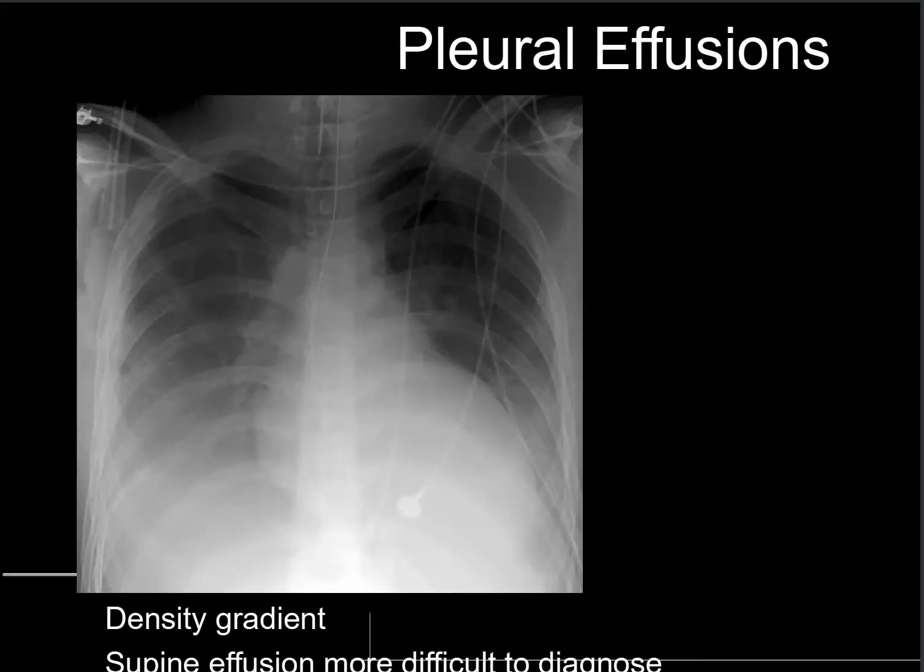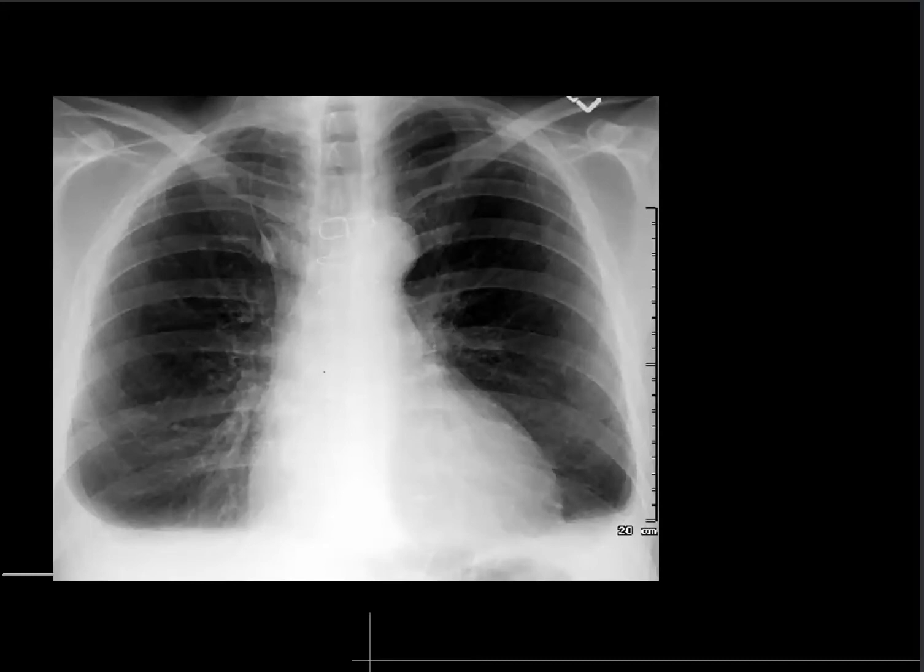What do you do with pleural effusions? Well, if big enough, they can lead to respiratory compromise, and you may have to drain them. And we actually do that in radiology. We do ultrasound guided drainage. We put a little probe on the chest wall, make sure that the heart is out of the way and we're in the right place, and we put these drains in and drain, or even aspirate for diagnosis.